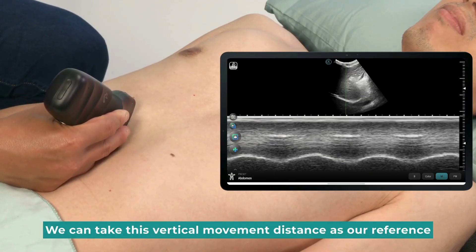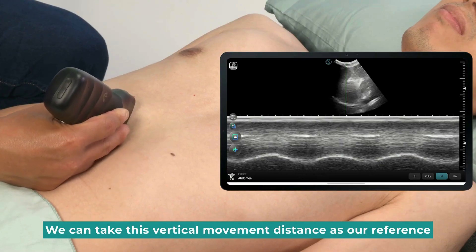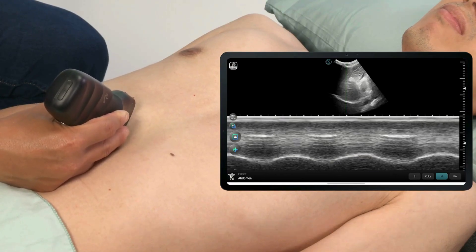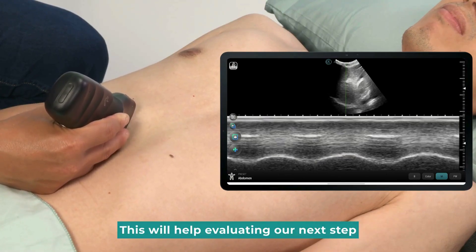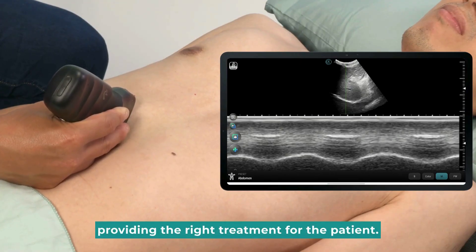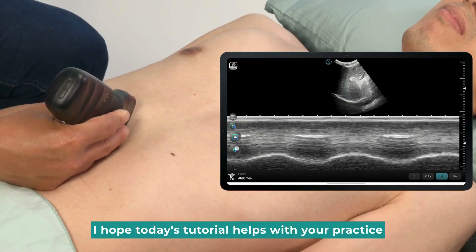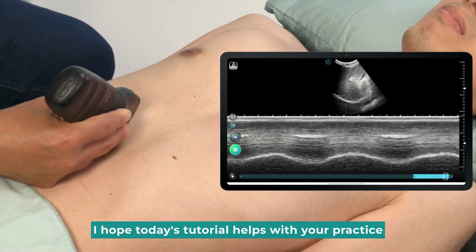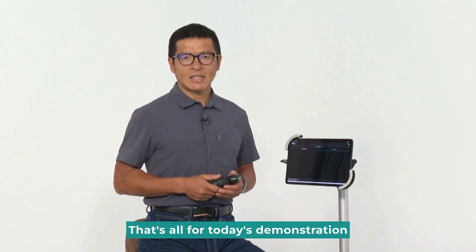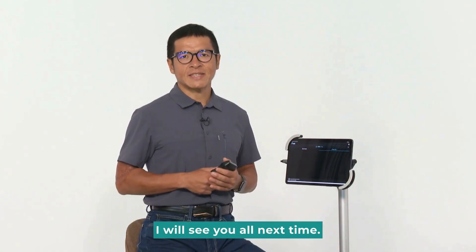We can take this vertical movement distance as our reference to see whether the patient's breathing ability is normal or not. This will help evaluating our next step, providing the right treatment for the patient. I hope today's tutorial helps with your practice. That's all for today's demonstration. I will see you all next time.